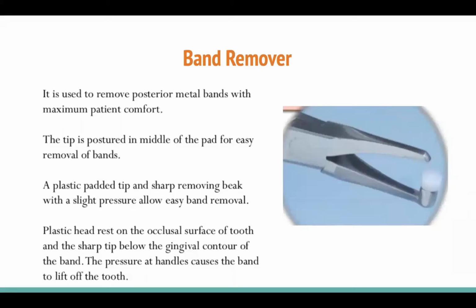And for a loose contact where you think that you are able to put a thick separator, you start with a thick. If it does not go, then thin separator. If it doesn't go, then brass wire. So when you use a thick separator, you have a very good space open, and the tight band can go easily inside, and your banding procedure is very easy.